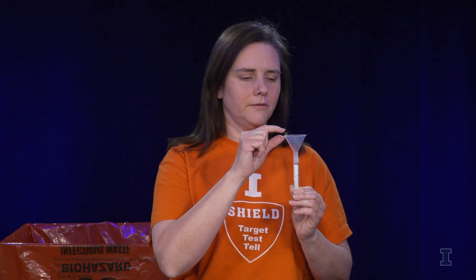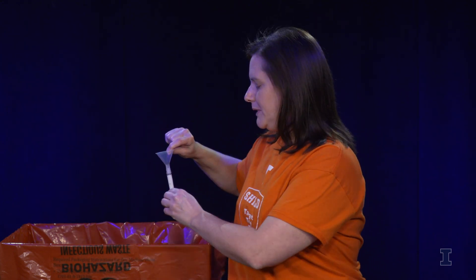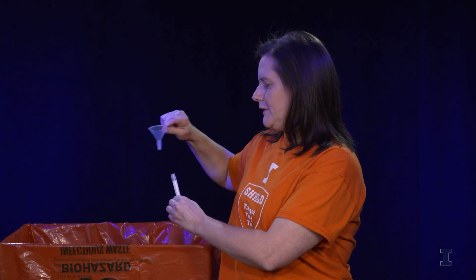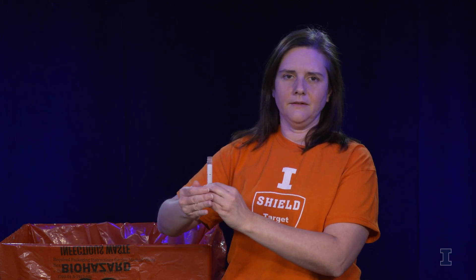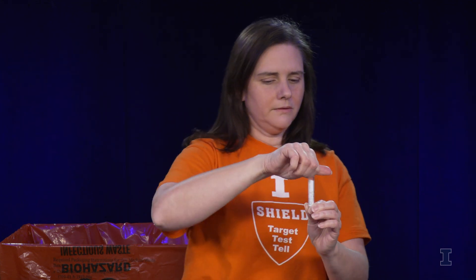Once your saliva has reached the 2 mL line, you are going to come over to your biohazard bin, place the funnel in the bin, and screw the lid on nice and tight. Then you are going to show the test tube to the person working at the collection station. They will verify that you have reached the 2 mL line with your sample and that it is a good quality sample.